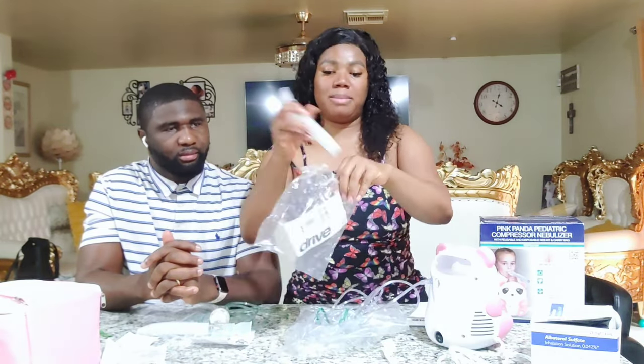So what we did is we actually went and cleaned everything up and all that stuff. And then we're gonna plug it up. We can get the baby. So make sure they're sitting upright. So you basically put it in. You were about to say something. Yeah, you wanna put it on power and see how that works. Plug it to power. Yes, I will.